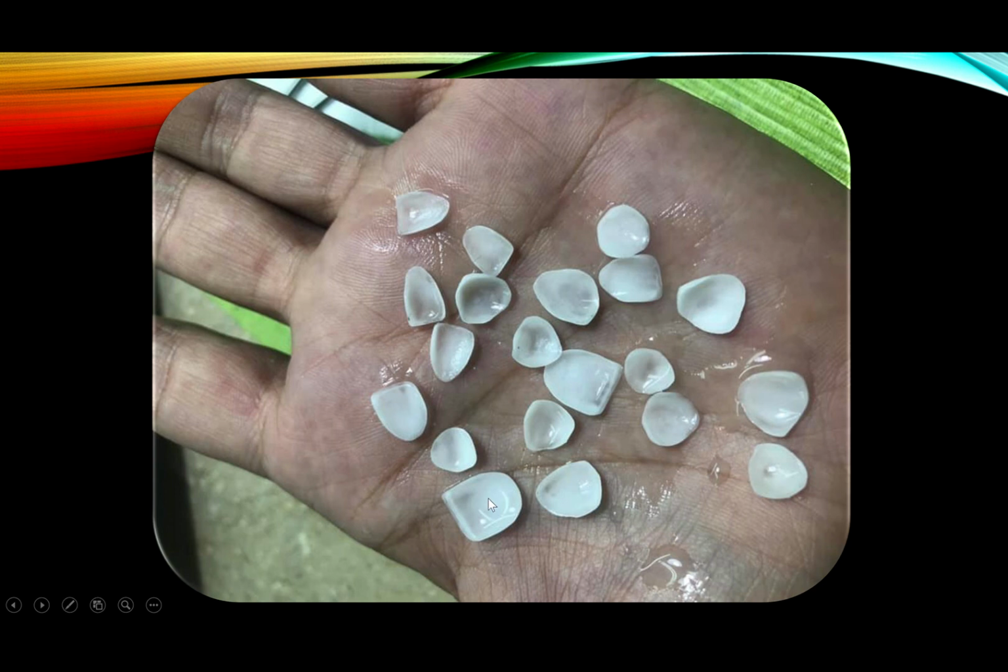Same thing here. You can barely layer anything in the centrals and laterals and canines, and the rest I don't layer at all. You see the premolars? They're thin anyway. What are you gonna layer here? Look at this premolar. It's barely a shell.